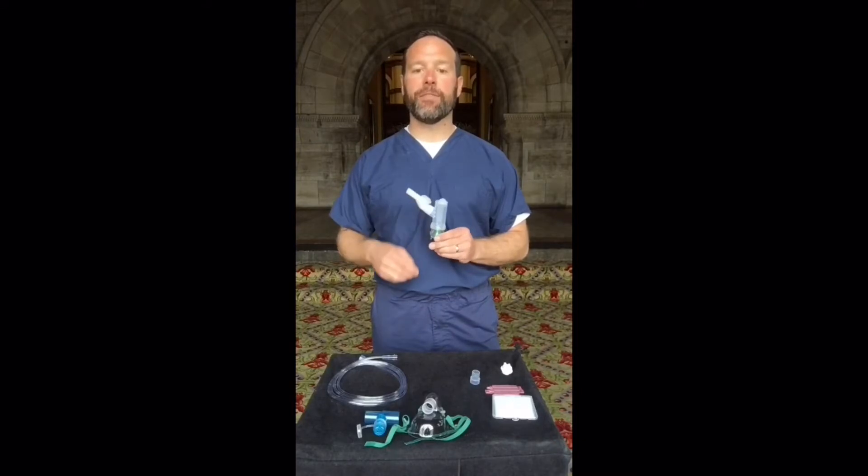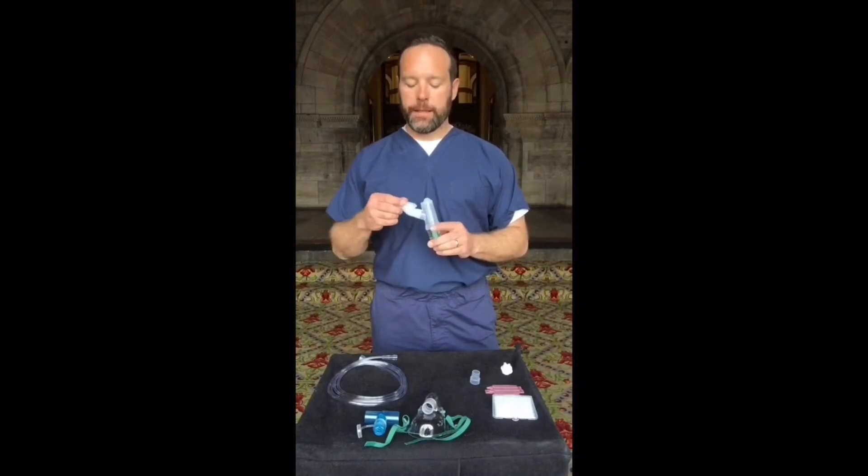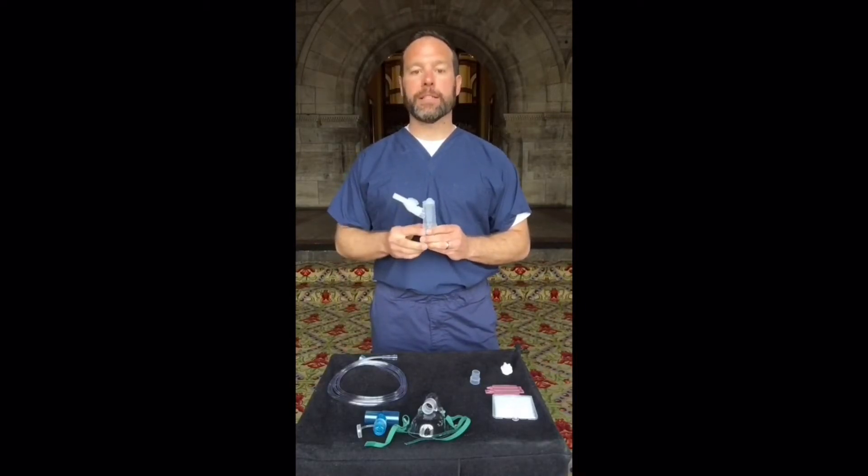The Nebutek is very, very fast. It will typically do a 3-milliliter unit dose in 3 to 5 minutes and can be used with any aerosolized medication.